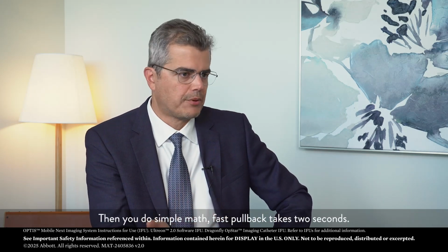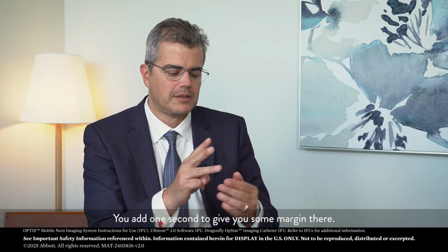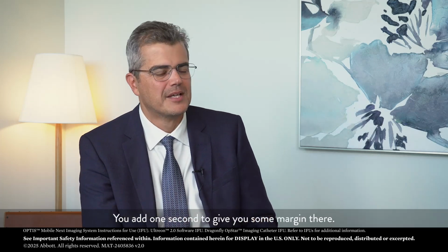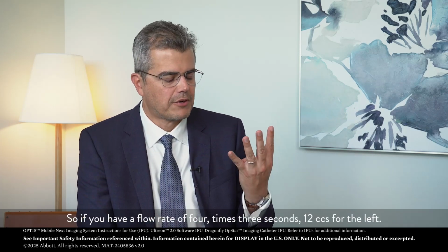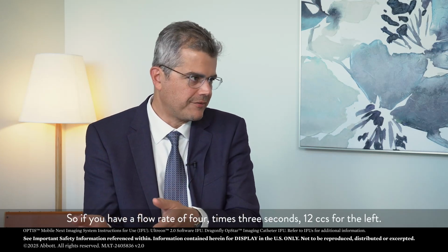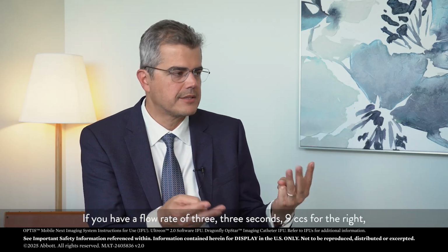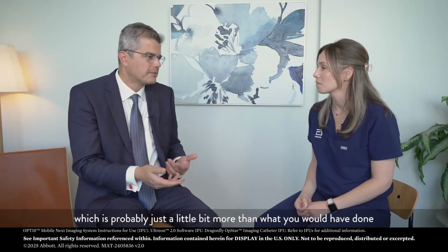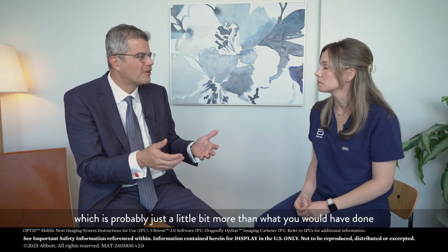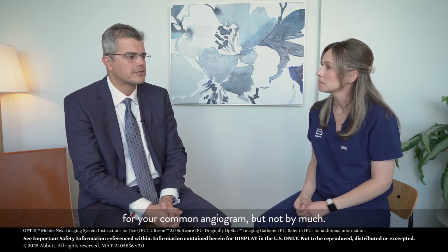Then you do a simple math. Fast pullback takes 2 seconds. You add 1 second to give you some margin there. So if you have a flow rate of 4 times 3 seconds, 12 cc's for the left. If you have a flow rate of 3 times 3 seconds, 9 cc's for the right, which is probably just a little bit more than what you would have done for your common angiogram, but not by much.